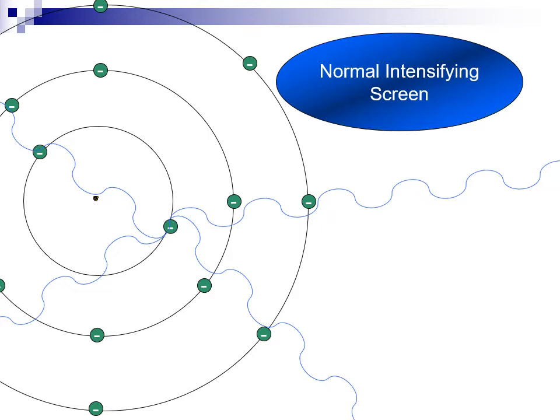You may be wondering why I'm presenting this nugget of X-ray history. The answer is that PSP plates are similar to intensifying screens in their use and function. PSP plates convert X-rays into light like intensifying screens, but with one important difference.